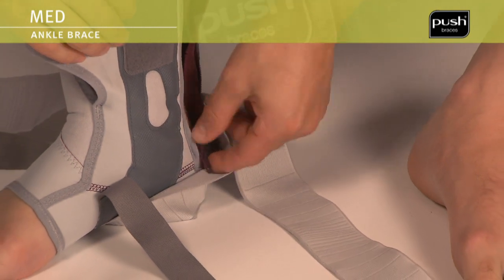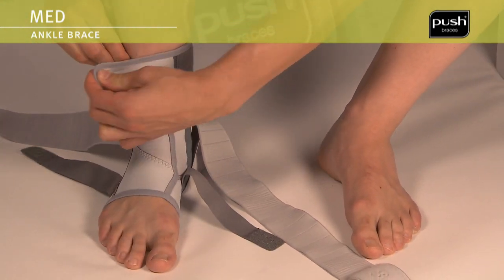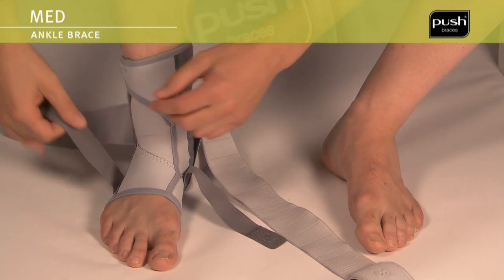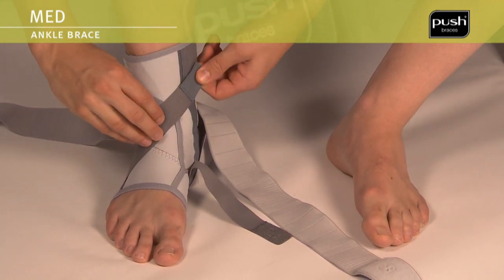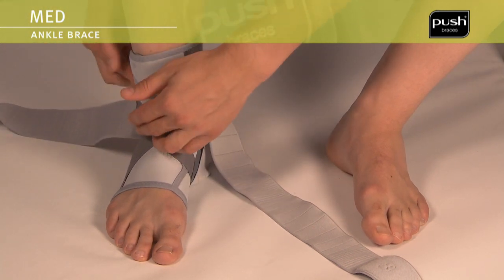Then close the zip and the elastic fastening at the front. Close the non-elastic bands crosswise across the instep. The correct fitting sequence is determined by the increasing molecule symbols on the Velcro.